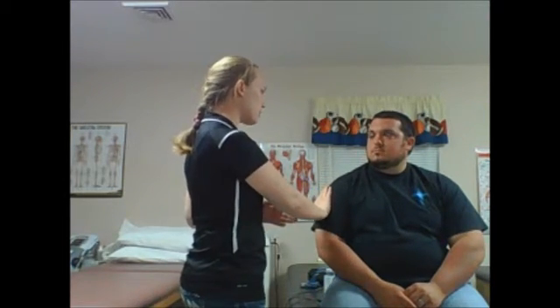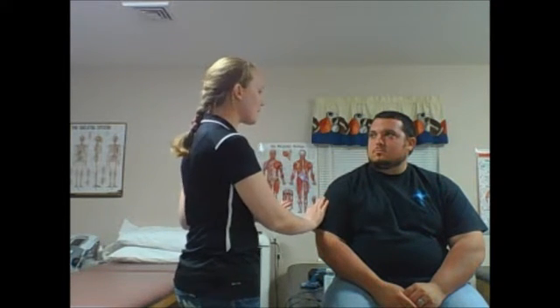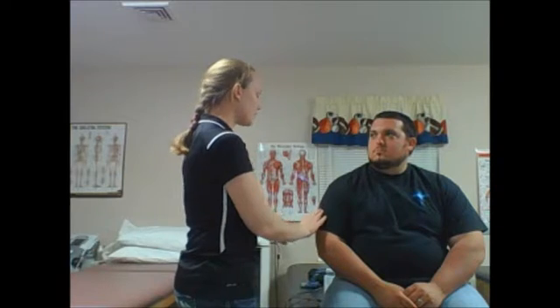Right? The first thing you want to do to make any kind of patient comfortable is to introduce yourself. So I'm Hannah. Nice to meet you. And you want to talk them through the steps so that they're very and completely comfortable with what's about to happen. I'm going to be using hydrocortisone, and we're going to be using it on your arm to help with the pain. You might feel a slight tingling. Some people don't feel anything. It all depends on how it's been applied.